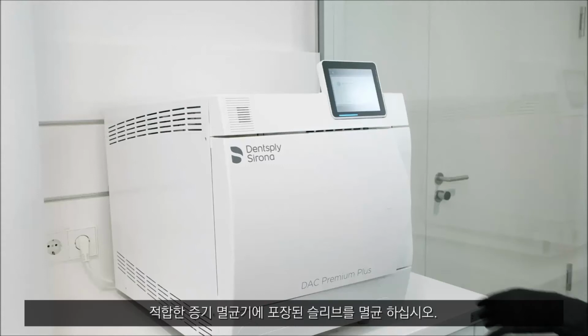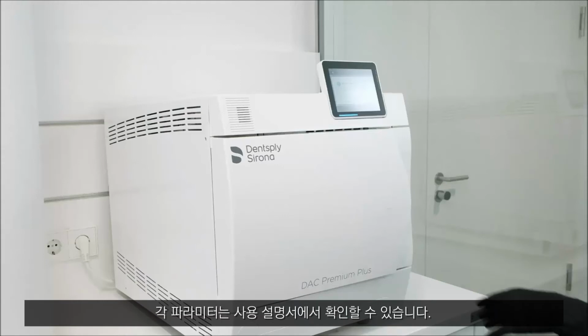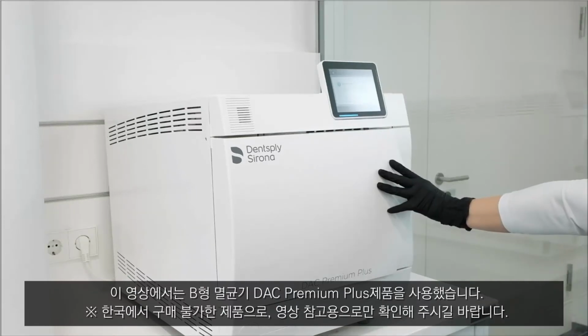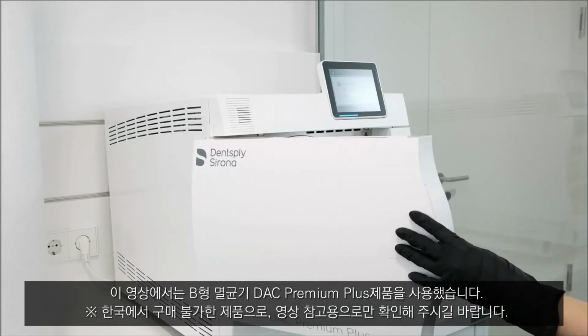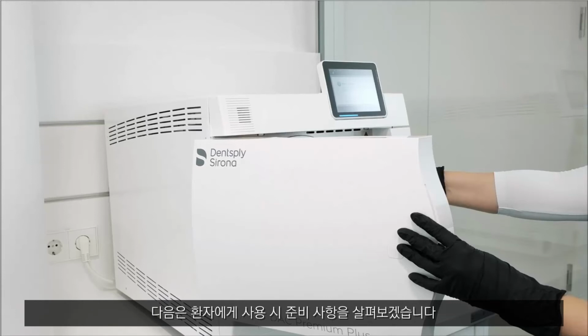Sterilize the packaged sleeve in a suitable steam sterilizer. Select the appropriate program and follow the load pattern specified by the manufacturer of the steam sterilizer. The respective parameters can be found in the instructions for use. In this example, we are using DAC Premium Plus, a Class B steam sterilizer. After sterilization, store the sleeve in a location that is free of contamination until it is used on a patient.